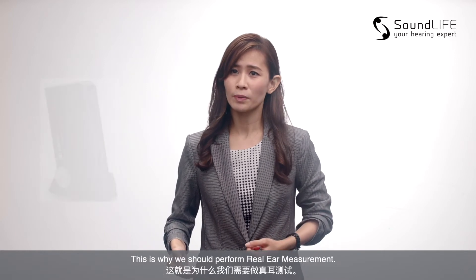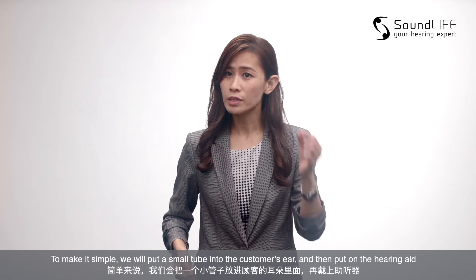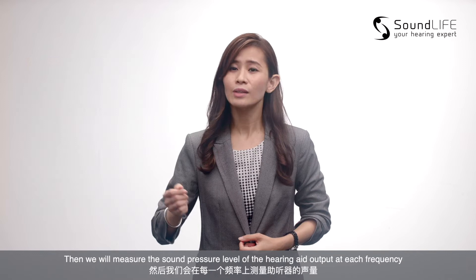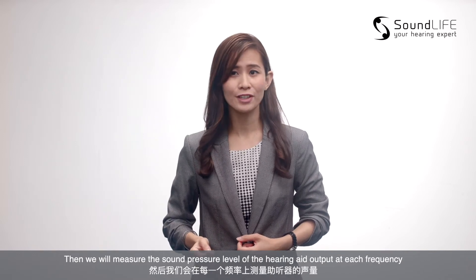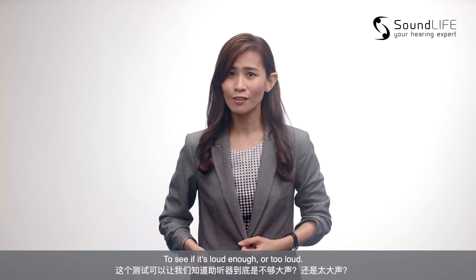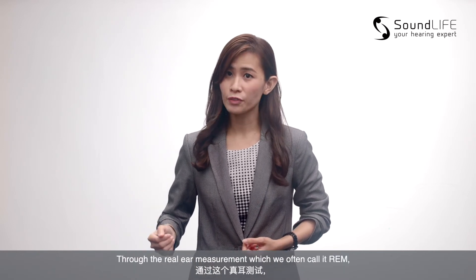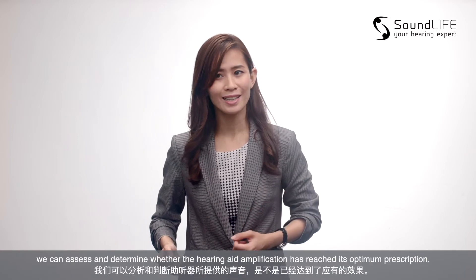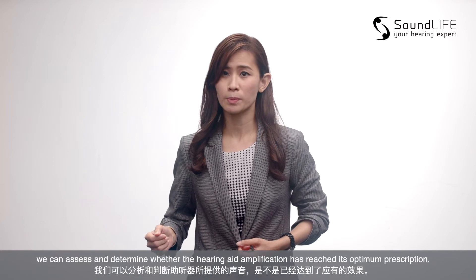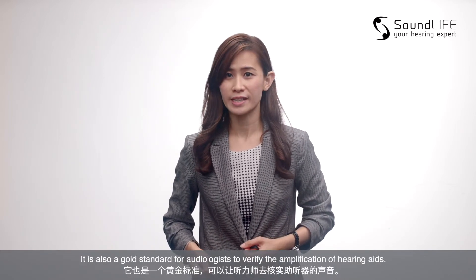This is why we should perform real ear measurement. To make it simple, we will put a small tube into the customer's ears and then put on the hearing aids. Then, we will measure the sound pressure level of the hearing output at each frequency to see if it is loud enough or too loud. Through real ear measurement, which we often call it REM, we can assess and determine whether the hearing amplification has reached its optimum prescription. It is also a gold standard for audiologists to verify the amplification of hearing aids.